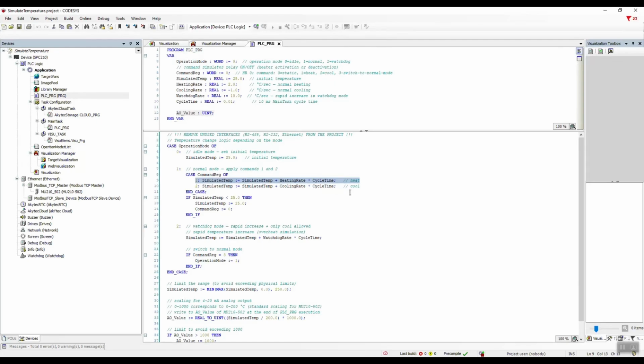So, with a heating rate of 2 degrees Celsius per second, the simulated temperature will increase by 0.02 degrees Celsius every 10 milliseconds. Next, if the emulator command is set to simulate cooling, then on each cycle of the main task, that is, every 10 milliseconds, we decrease the simulated temperature inside the sterilizer according to the specified cooling rate. If the simulated temperature drops below 25 degrees Celsius, we set the simulated temperature to 25 degrees Celsius.